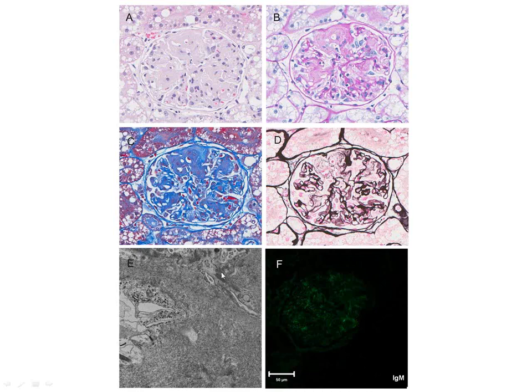And then at about 9 o'clock, that area is probably the endocapillary surface. Yep. What you're basically seeing is this finely granular, I don't know if that's an appropriate term for boards, but I don't know if those are fibrils or if that's just finely granular within the basement membrane. You almost can't even see normal versus abnormal.